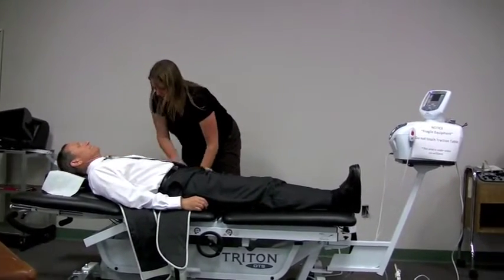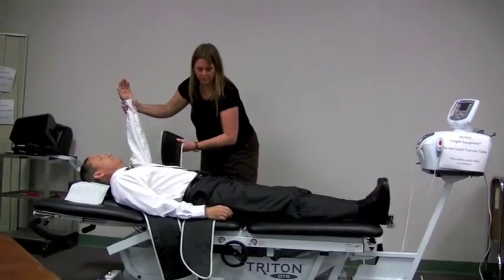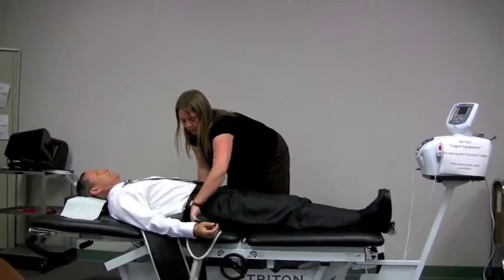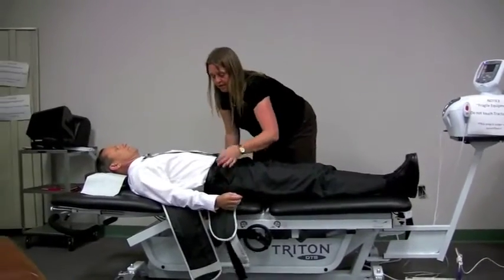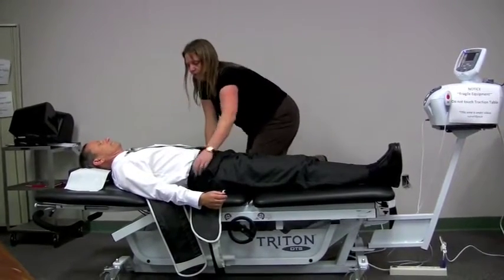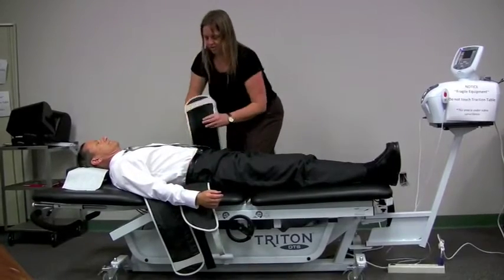And you may need to, let's check, I'm going to check where the thoracic piece is. Oh, I think he ended up just perfect. Now, the goal is to have his back right about where the gap is in the table. We want this lumbar piece to go over his iliac crest. So this may need to go just up a little bit. I'm just going to bring it up just a smidge. There you go. We'll rearrange it if we have to.